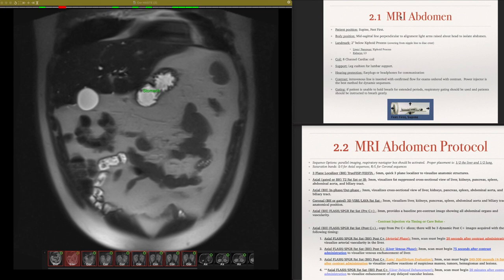Two inches below the xiphoid process is the centering line. You want to basically cover from around the nipple line down to the iliac crest. In this case, to our left is a patient with polycystic kidney disease, so the kidneys are much larger than a normal kidney. So you really are going to have to extend lower. And again, no patient is ever the same, so you have to be able to accommodate anything that you see. And you always want to make sure that you cover everything.